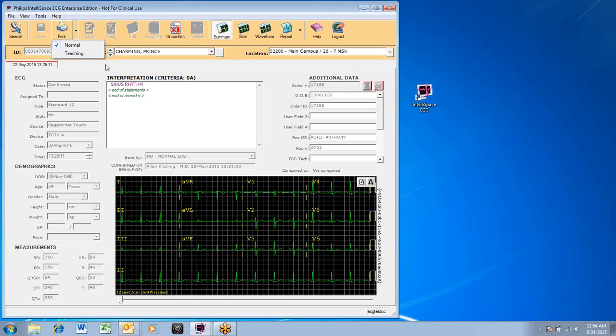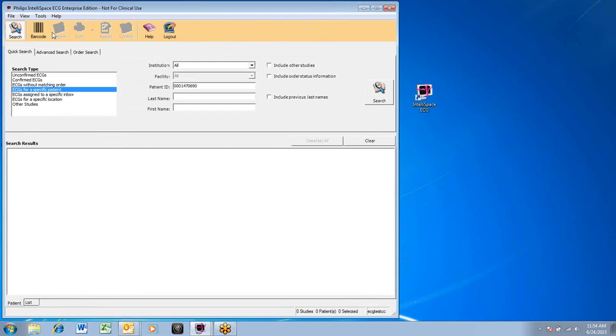To search for another patient's ECG, simply click the search button. The logout button can be found on the far right of the screen.